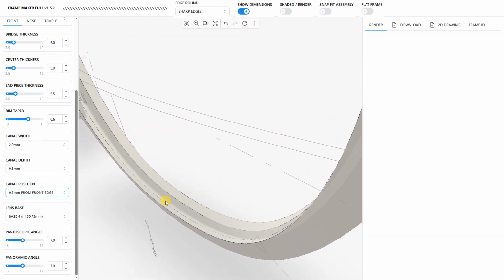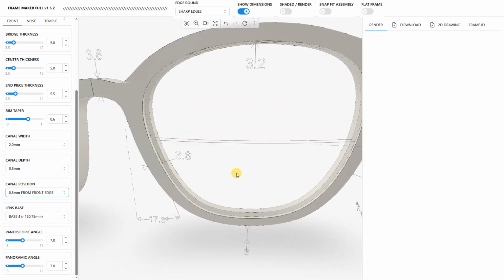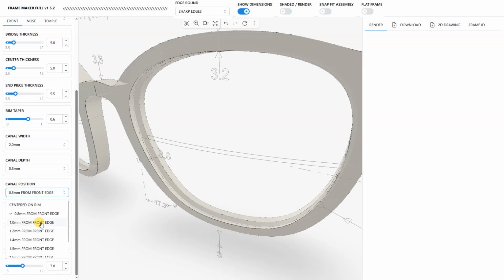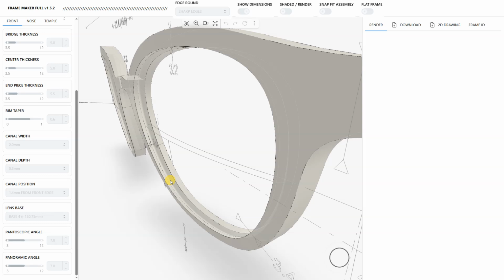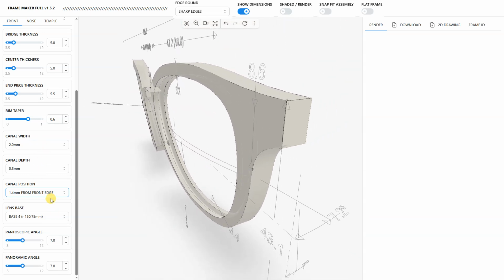So there it is. I know that this is 0.8. That can be an option or not. I can add some more. I can take it more to the back. For now, I have been using it always centered because I had no reason to go more to the front or more to the back. But this is something that you would have to test, and each design would require something different. That's why I'm giving many options there to play with, depending on the thicknesses that you've specified previously.